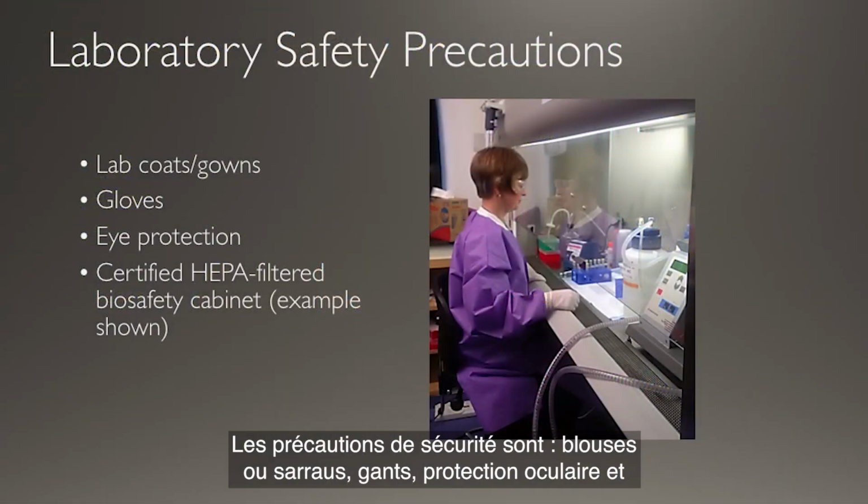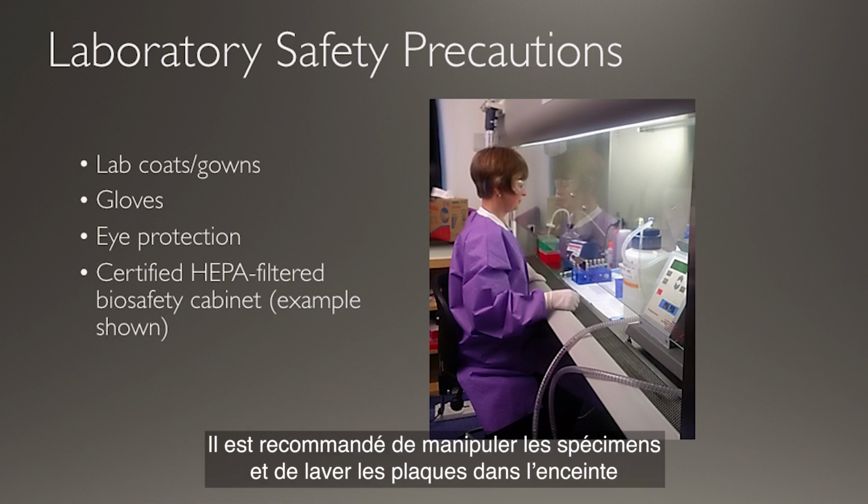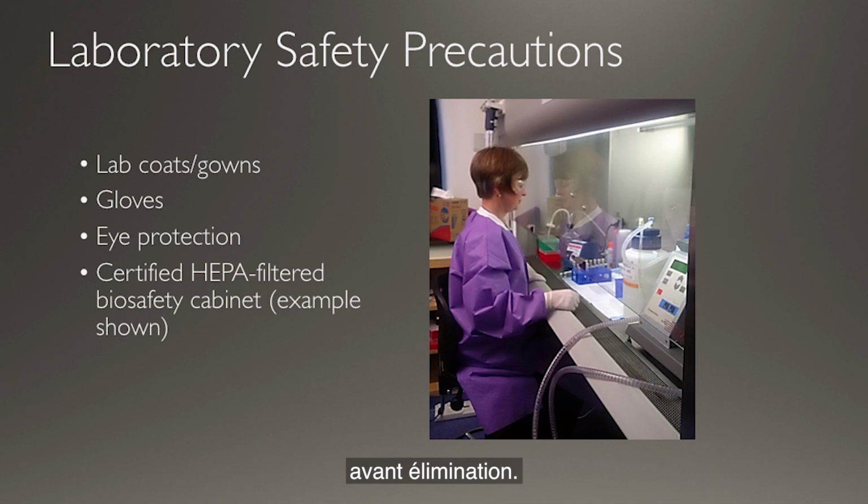Laboratory safety precautions include the use of lab coats or gowns, gloves, eye protection, and certified HEPA-filtered biosafety cabinets. It is recommended that manipulations of the specimens and plate washing are performed in the biosafety cabinet, and that liquid waste is decontaminated using bleach prior to disposal.